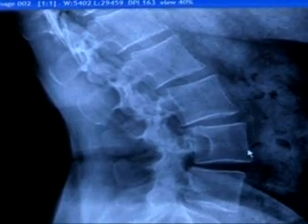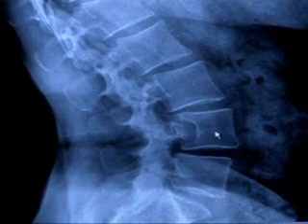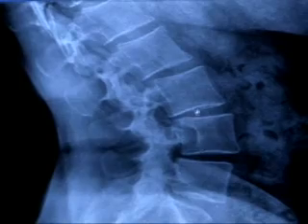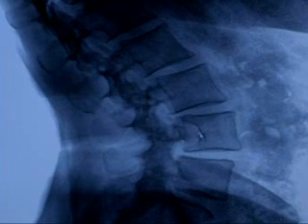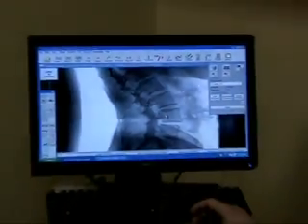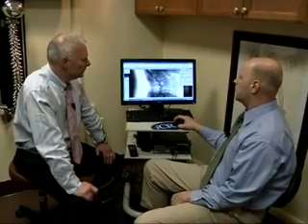So before we would say, oh, this patient may just have a slight what we call spondylolisthesis or anterolisthesis, or slippage forward of the vertebrae. But what's causing that? In this image, we can actually determine by inverting it, we see a significant whitening here, and that would indicate a soft tissue tumor that's growing out of the spinal column and around. So we can send this patient to a neurosurgeon or for an MRI and get some other imaging, which we may not have done in the past, because we would look at this and say, looks pretty normal to me, other than a simple displacement of the L4 vertebrae.